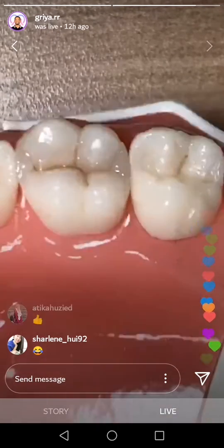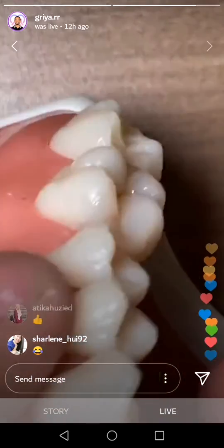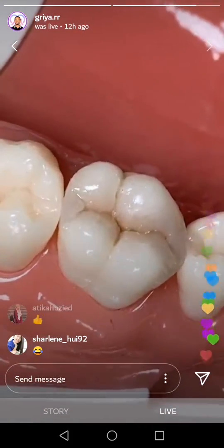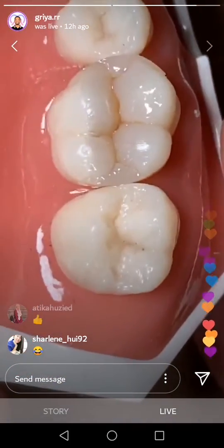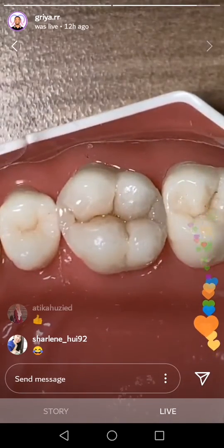You want to see my anatomy? Yeah, you can check. This is my ugly anatomy. See? Check again. See, is this good or no? Yeah, this is for practice. Yeah, not serious.